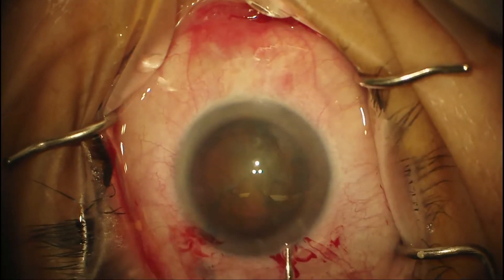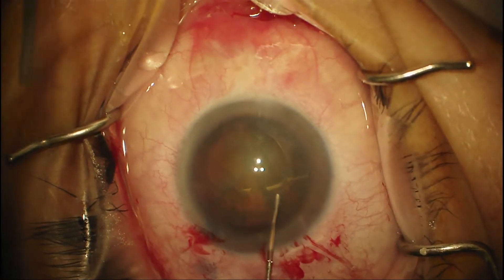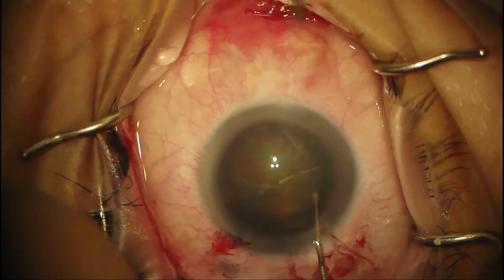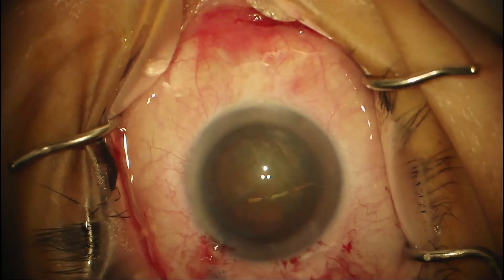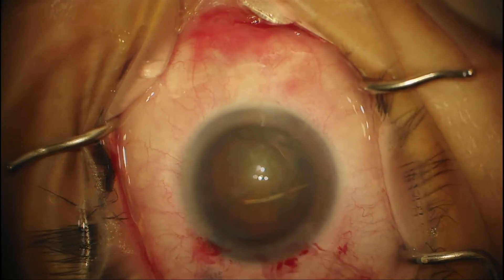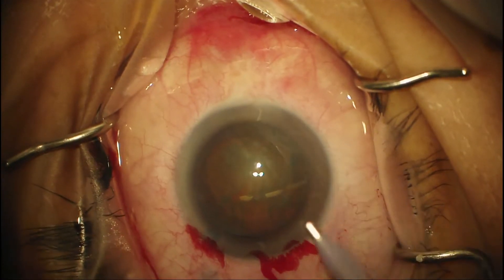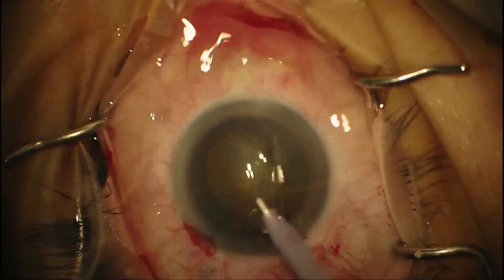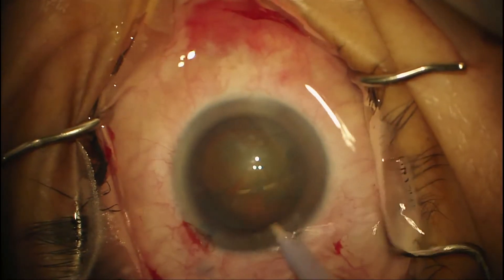So there I got another cannula of BSS. I'm trying to turn it right here — oh, I can turn it already. So that tells me the zonules are good and I can proceed with phaco. The next thing would be to get the phaco handpiece, and I like to insert it upside down so that I don't use the sharp end down by the iris or the capsule.